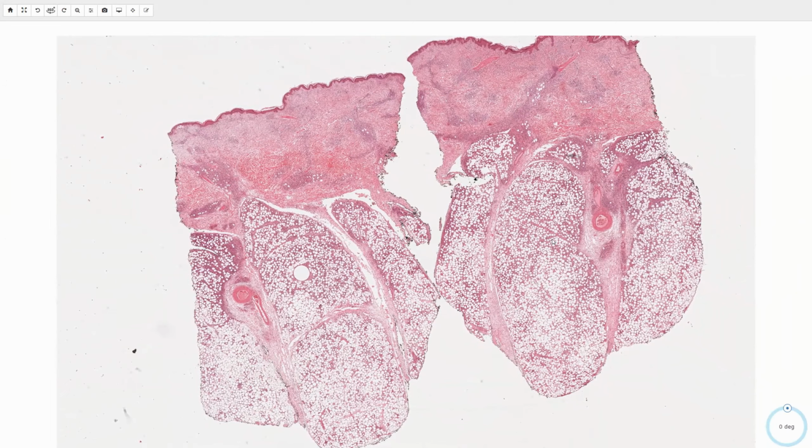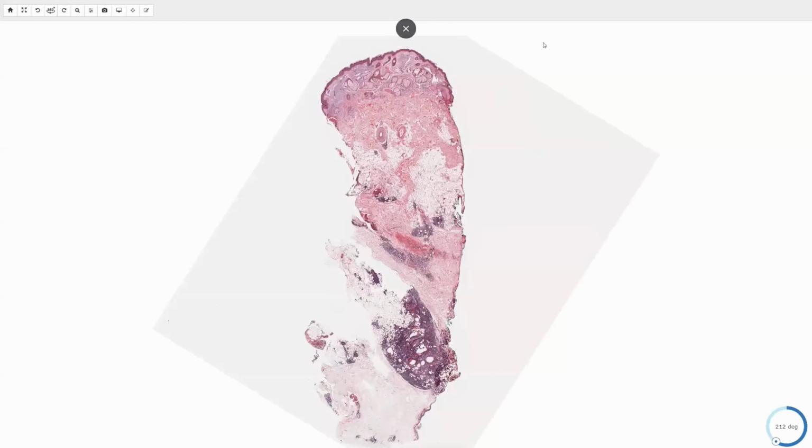But the atypical lymphoid infiltrate may be present in association with an underlying lymphoproliferative disorder. And again, that's a lobular panniculitis as opposed to a mixed lobular and septal panniculitis. And then you might also consider an extranodal NK T-cell lymphoma, much more high-grade atypia and tends to have more necrosis. And then lastly, I'd just like to touch on leukemia cutis.